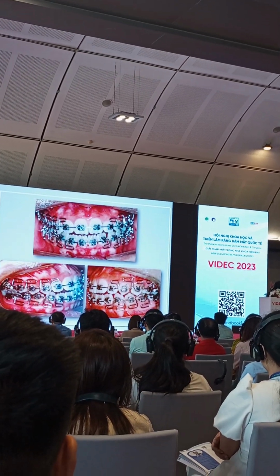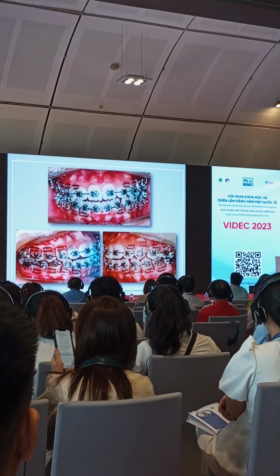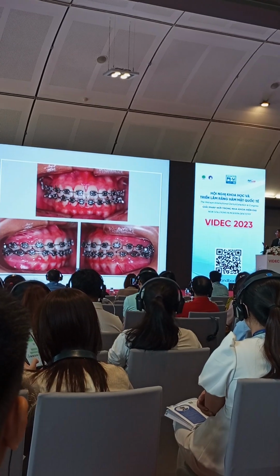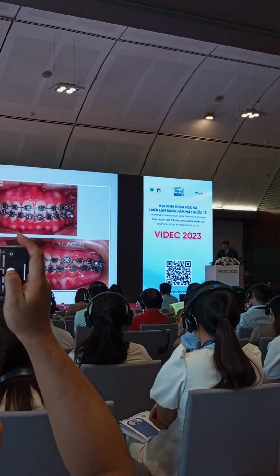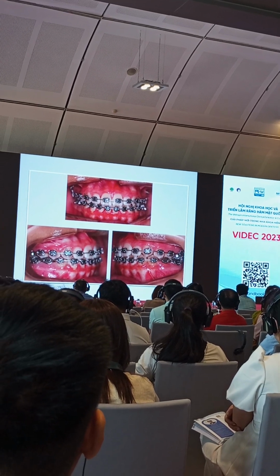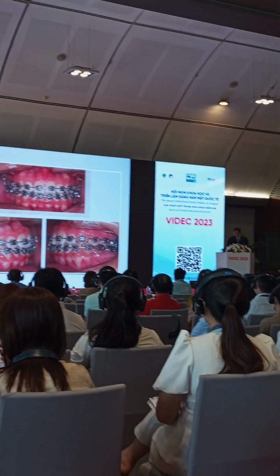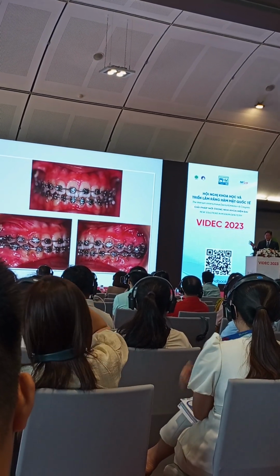So after that, the bite started to close, I just continue with my application on my posterior segment until I was able to close the bite, and then I removed my meaw wire, and then I will try to do the correcting of the interdigitation. So just continue with it. Patient is not wearing any elastics anymore, although she never wore it beforehand. So I tried to interdigitate on the premolar area.